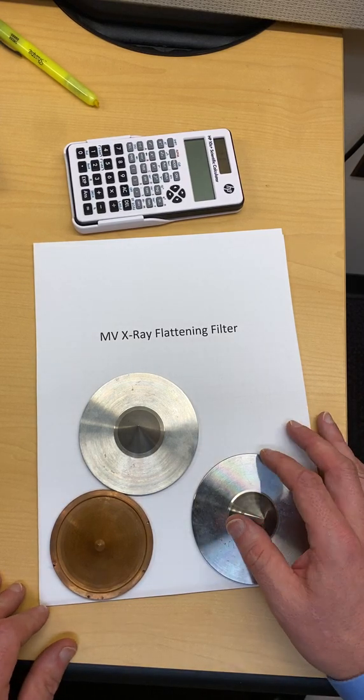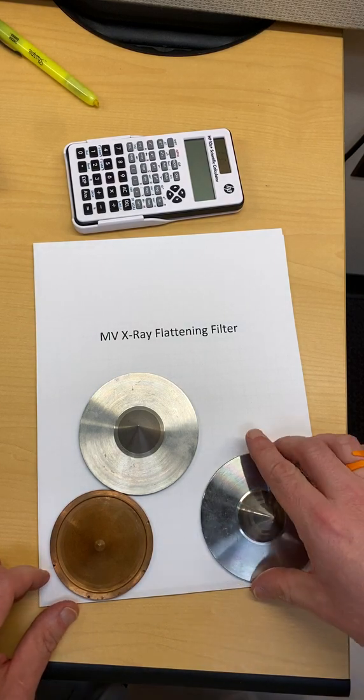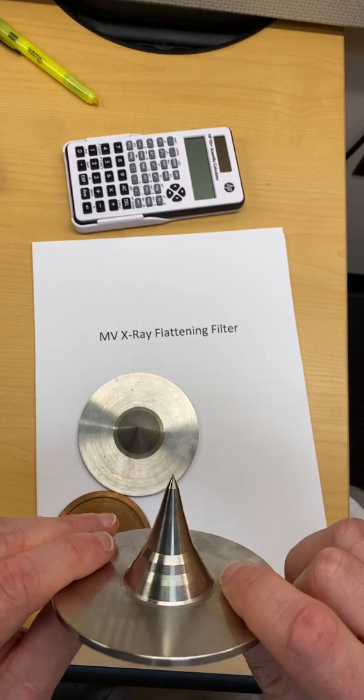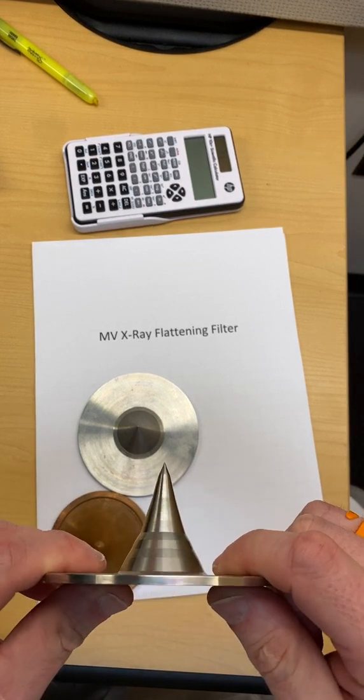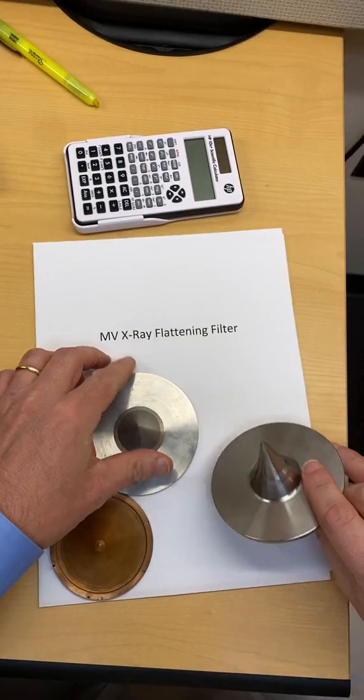Okay, so here we have some flattening filters, MV X-ray flattening filters, and this is the device that's up in the head of the machine that's designed to attenuate a non-flat X-ray beam and turn it flat. So you can see they're cone-shaped.